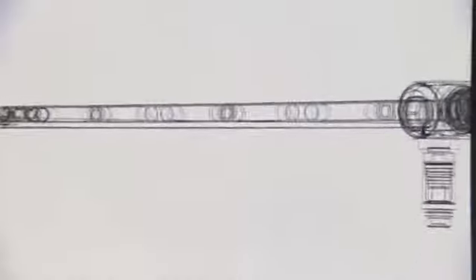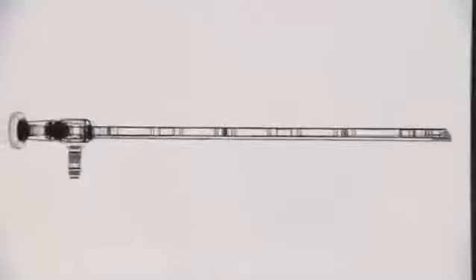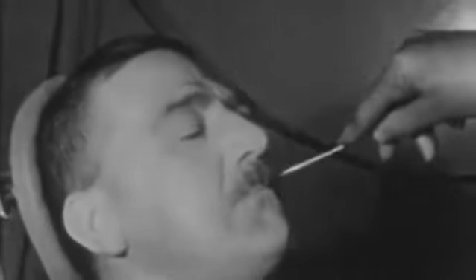In this video, we will look into endoscope devices. Let's look where it all began. The endoscope, an instrument that allows us to peek inside of the human body, was used as early as the ancient Greek and Roman periods. An instrument considered a prototype of endoscopes was evidenced and discovered in the ruins of Pompeii.